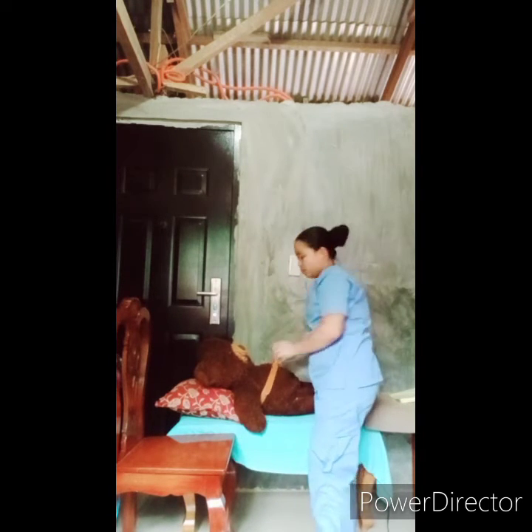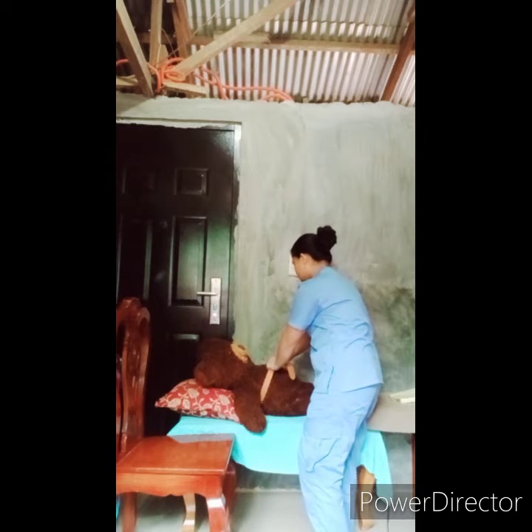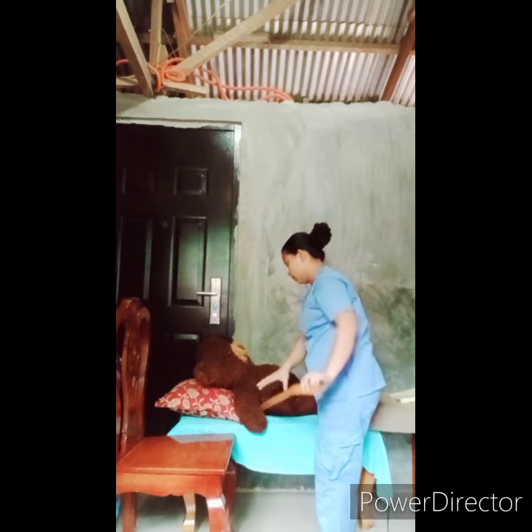And then next, let's remove the transfer belt to make the patient comfortable. Then place it in its proper place. So now I am done using the pivot technique in transferring the patient from the wheelchair to the bed.